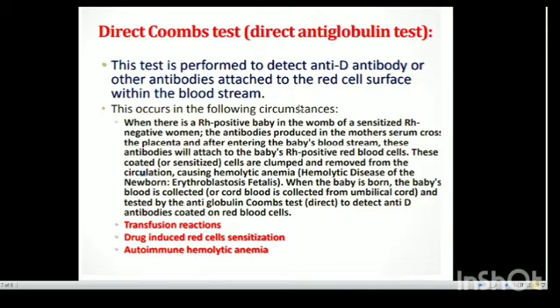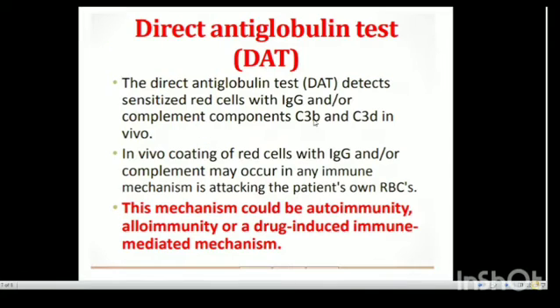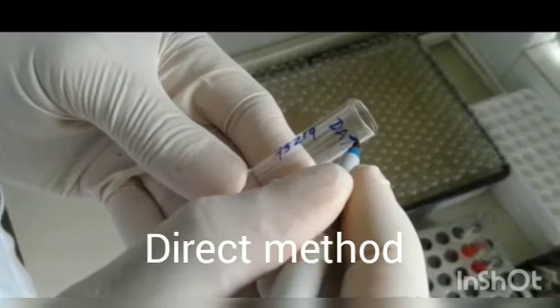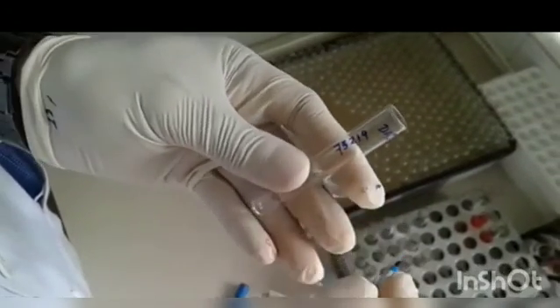So let's go into the procedure. Coming to the procedure, we have to first label the Coomb tubes. As you can see, we have to label them properly in order not to mix up with other samples.